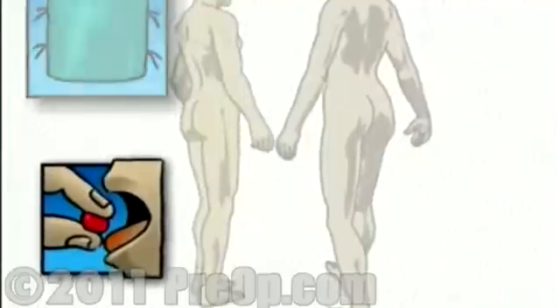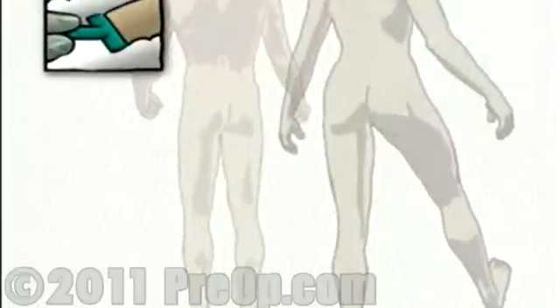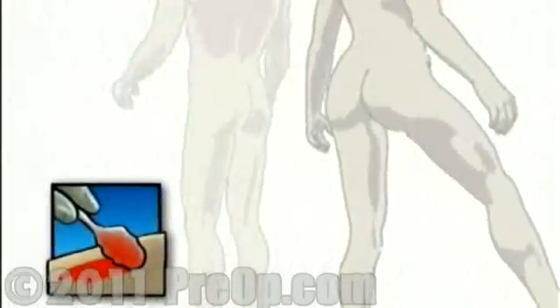On the day of your operation, you will be asked to put on a surgical gown. You may receive a sedative by mouth and an intravenous line may be put in. You will then be transferred to the operating table. In the operating room, a nurse will begin preparation by shaving your leg. The surgeon will then apply antiseptic solution to the skin around the knee and then place a sterile drape around the operative site.